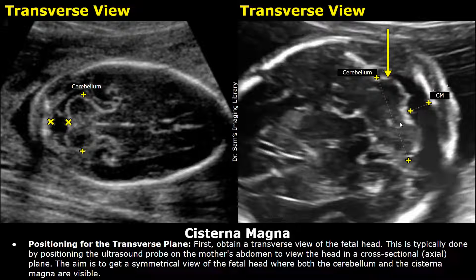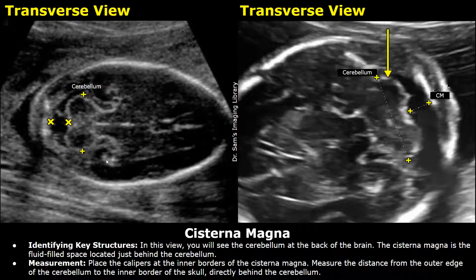To measure the cisterna magna, first obtain a transverse or axial view of the fetal head. Identify the key structures, which includes mainly the cerebellum at the back of the brain. The cisterna magna is the fluid-filled anechoic space just behind the cerebellum.